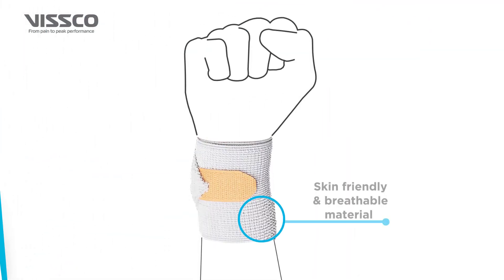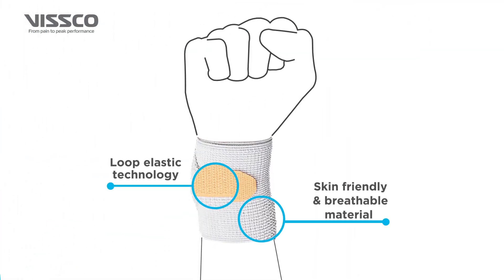It is made up of skin-friendly and breathable material. The Loop Elastic Technology is used for ease of comfort and perfect fitting.